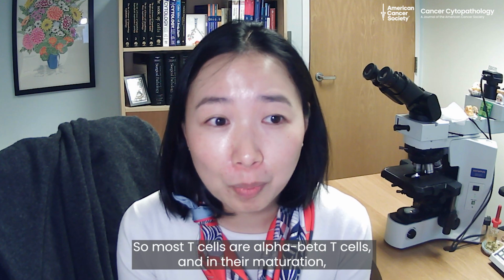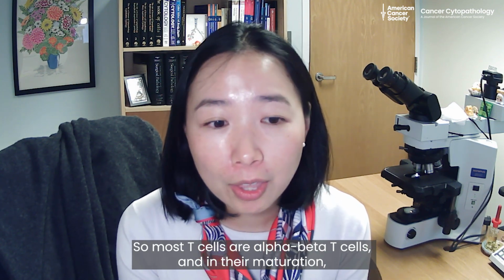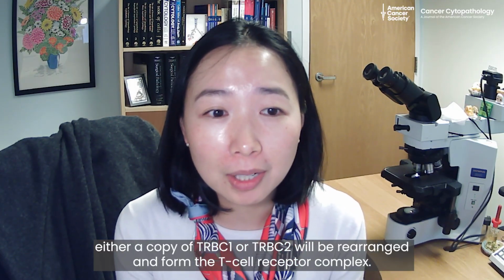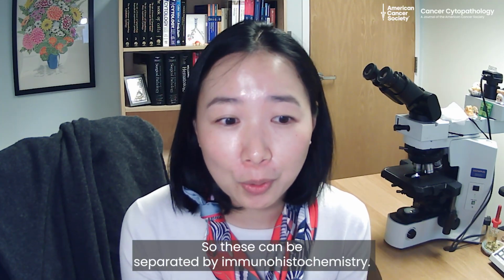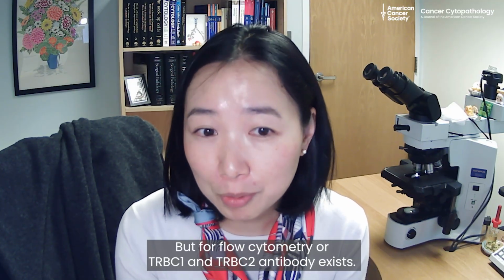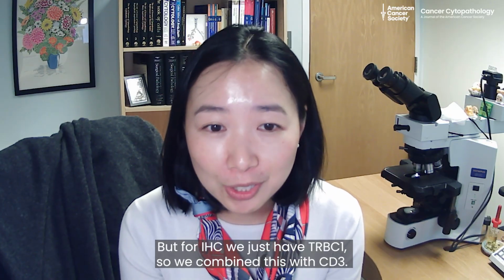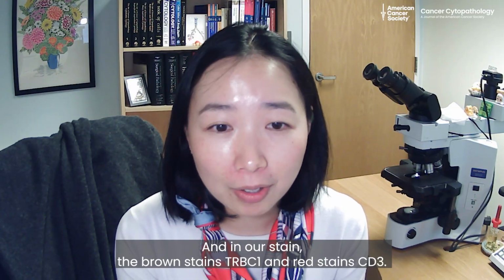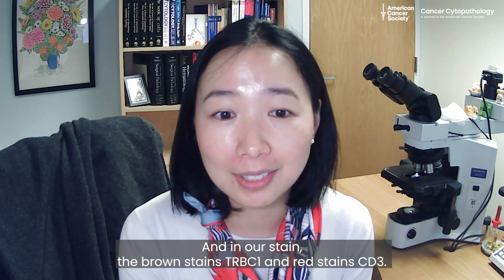So most T cells are alpha beta T cells, and in their maturation, either a copy of TRBC1 or TRBC2 will be rearranged and form the T cell receptor complex. So these can be separated by immunohistochemistry, but for flow cytometry, our TRBC1 and TRBC2 antibody exists. But for IHC, we just have TRBC1, so we combine this with CD3. And in our stain, the brown stains TRBC1 and the red stains CD3.